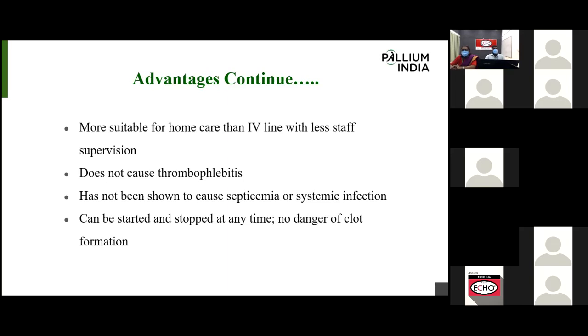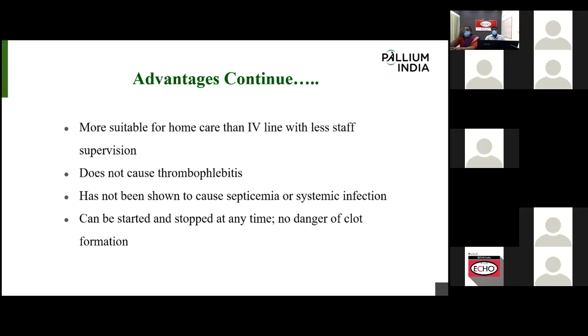Then if we feel any clot formation in the subcutaneous line, we need to change the site. Normally it will not occur. Anything we notice, we need to change the site.